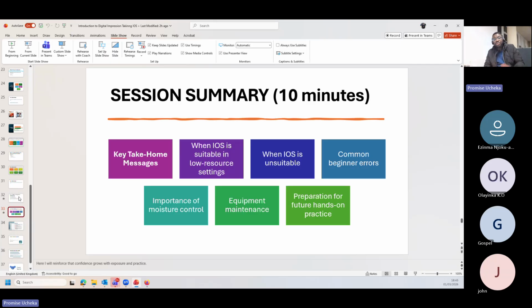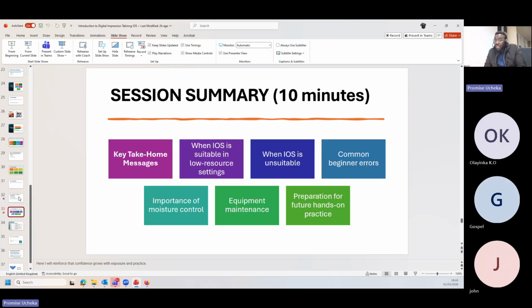Because you need to think about, yes, we've acquired this, but what's our patient pool with this? How many times are we going to use this? Or are we going to invest tens of millions into this and then have it somewhere on the shelf? Okay, so that is one thing that you need to think about. So always think about the suitability of your own practice.